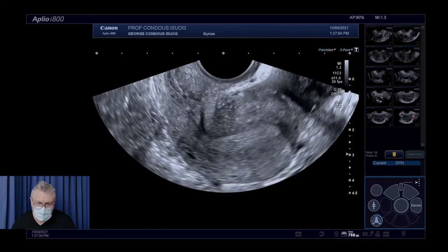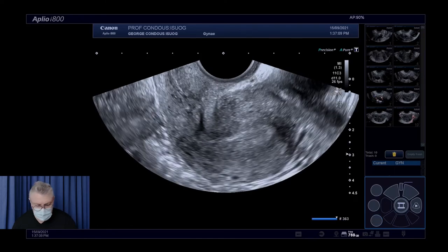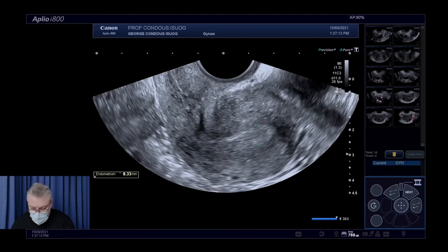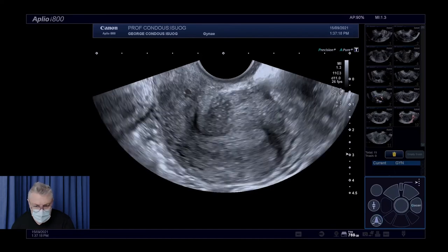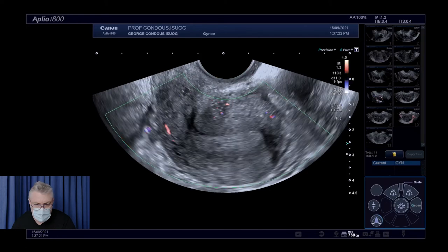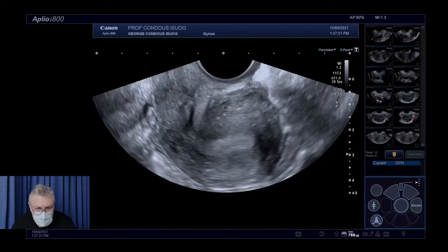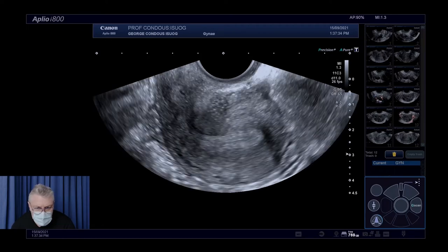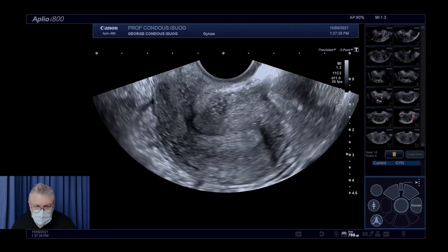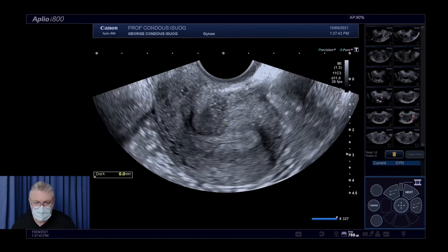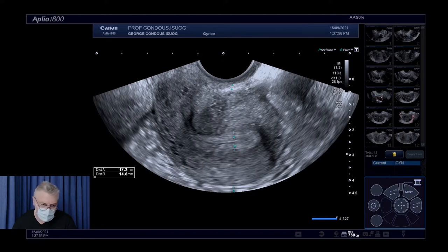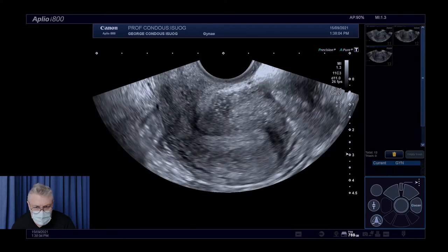The endometrium itself looks reasonably okay and we'll measure it, then place colour Doppler — a relatively avascular endometrium, which is good. Moving the probe from side to side looking specifically at the myometrium, there isn't necessarily any obvious asymmetry between the posterior and anterior myometrial walls — slight asymmetry of 17 versus 15 millimeters. However, a uterine contraction alone can cause some asymmetry, so asymmetry on its own is not strong evidence for myometrial pathology such as adenomyosis.